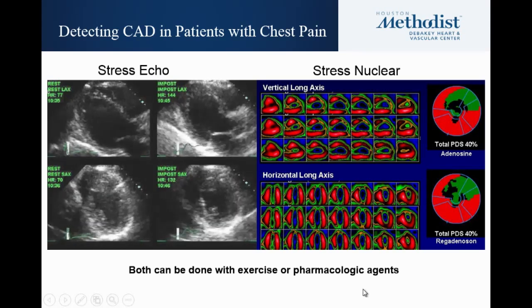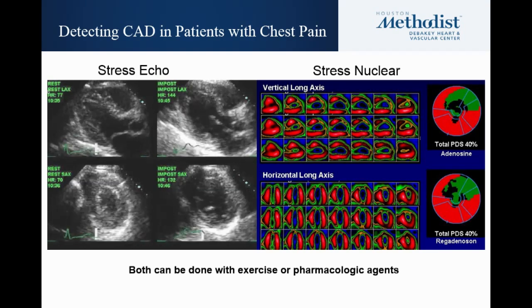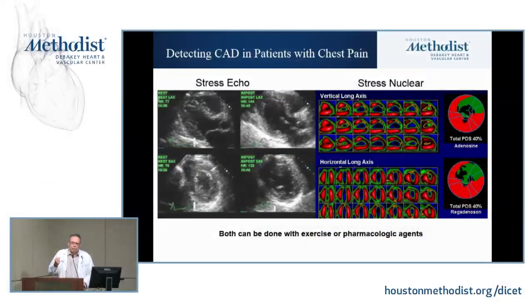However, as I pointed out a few weeks ago when we did the stress echo lecture, dobutamine stress echo is not as accurate as pharmacologic SPECT for several reasons. We pointed them out a few weeks ago, particularly with smaller hearts, hypertensive people that have LVH. They can become so hyperdynamic that you cannot pick up ischemia, even though they do have it.